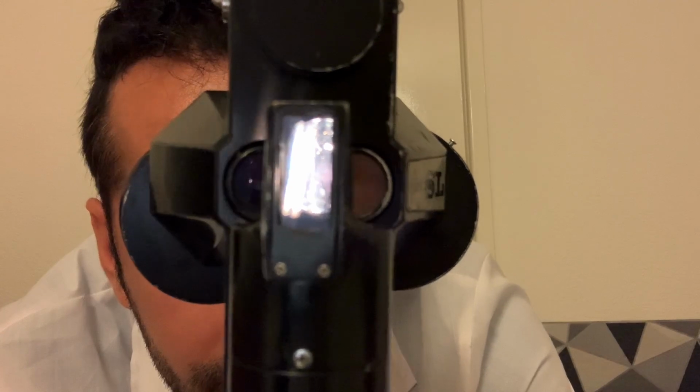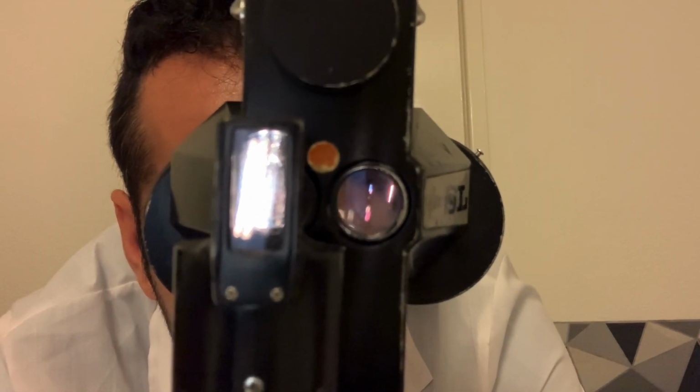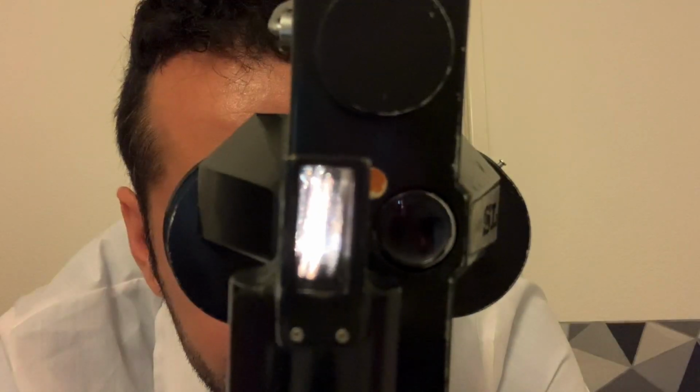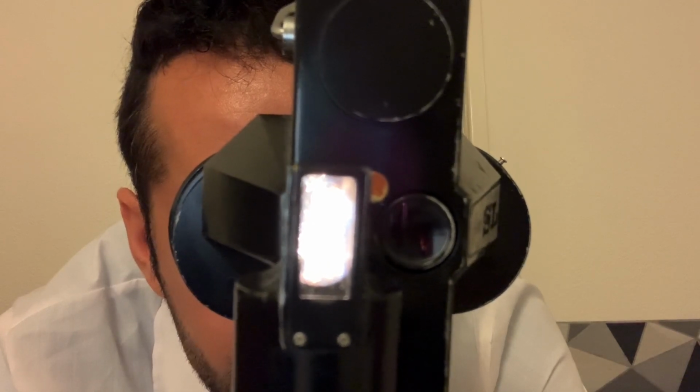Good. Okay. So slight contact lens decentration nasally, but still full corneal coverage. Up gaze blink 0.4 approximately. Good. Push up 60%. Smooth, fast recovery. Excellent.